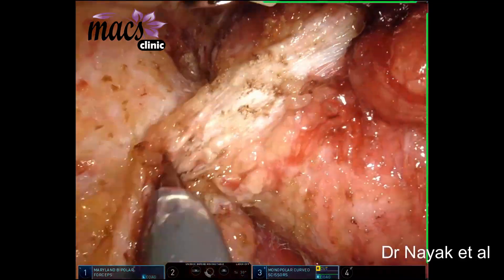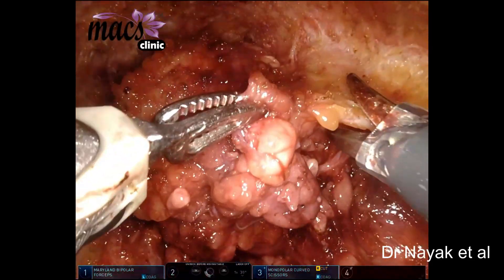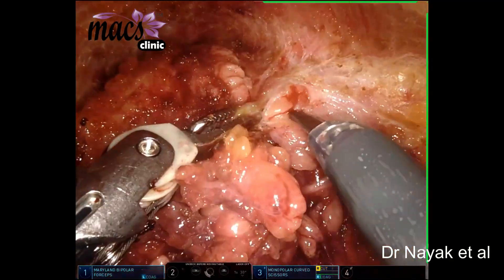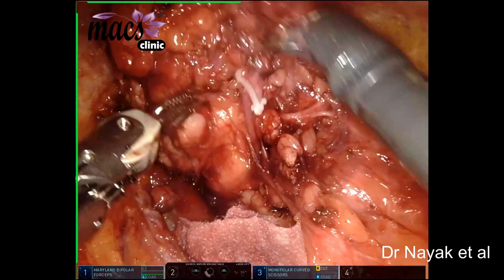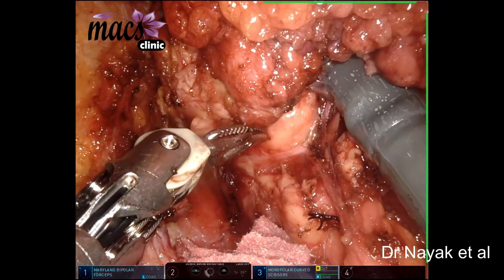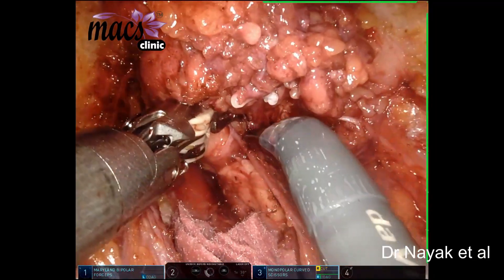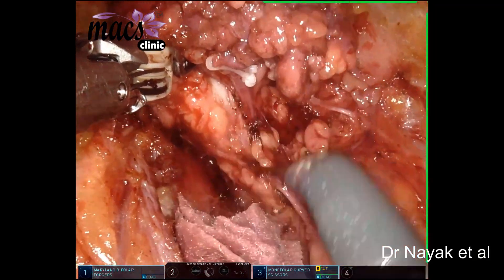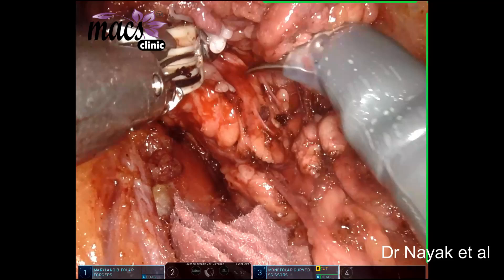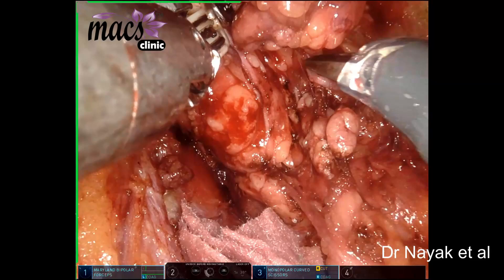It is a dissection of the posterior aspect of the parotid gland. You can see the cervical branch of the facial nerve here, which is being dissected down. This nerve can be cut; however, in this case we are using it as a landmark to guide us to the trunk of the facial nerve, so we prefer to retain it in the PREA technique. You can see the nerve above — that is the marginal mandibular.